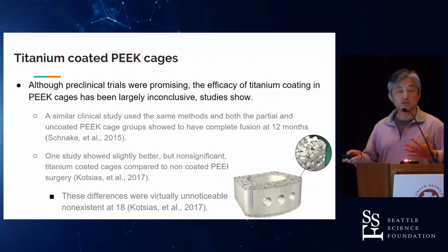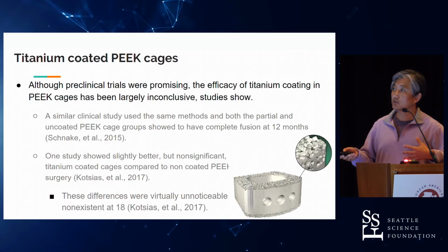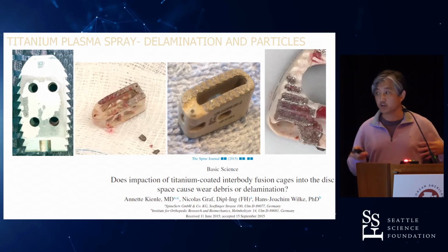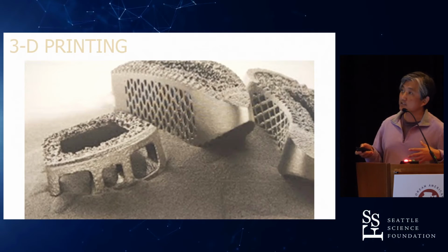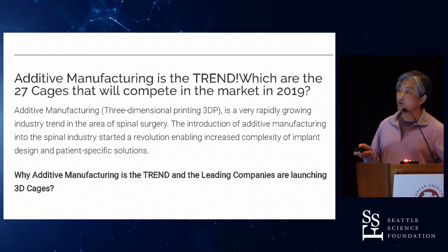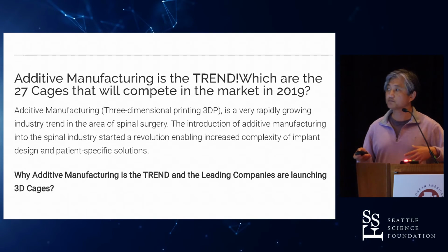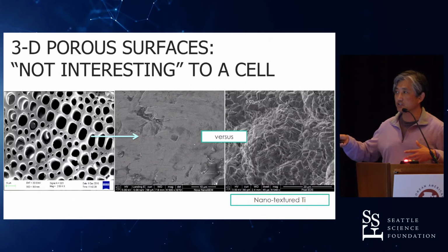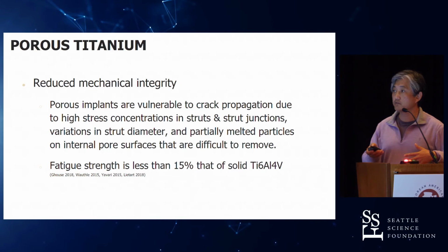With PEEK cages, when you add titanium to the surface of the implants, the problem is it comes off. That's been reported. There are papers that suggest that. So maybe that's not the kind of implant you want to be using with titanium. Lastly, 3D printing. We know that that is a revolution in the sense that it is certainly being done by almost all companies. But there is some data coming out that perhaps these porous cages are not nearly as good, that there's more fibrous formation rather than bony formation when you're looking at electron microscopy pictures.